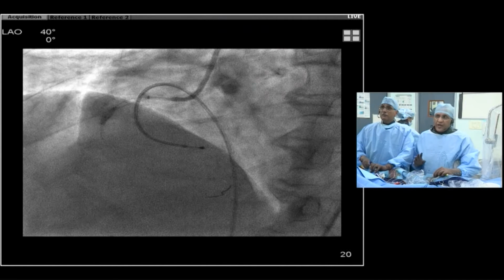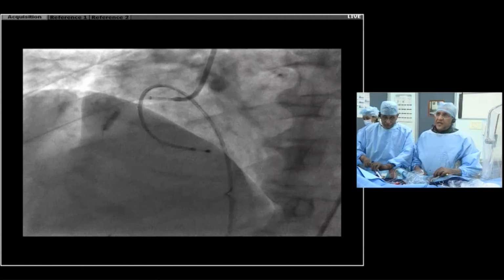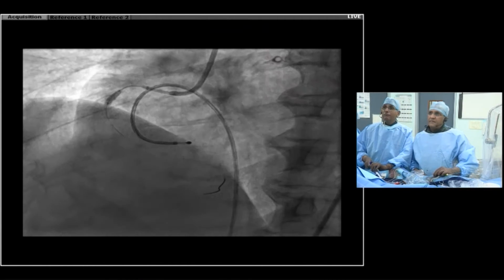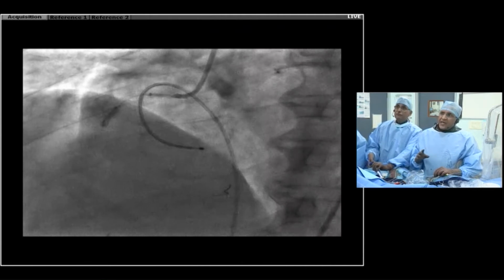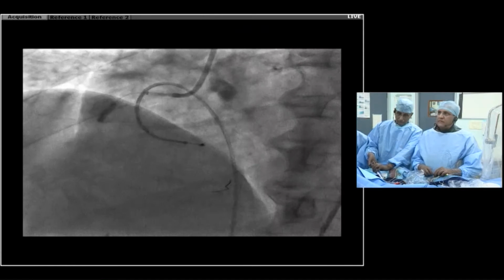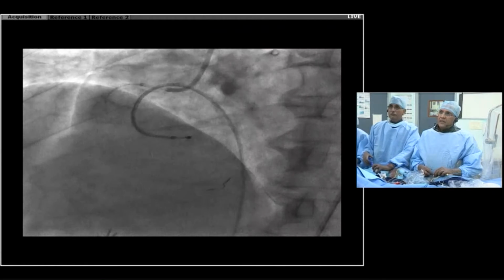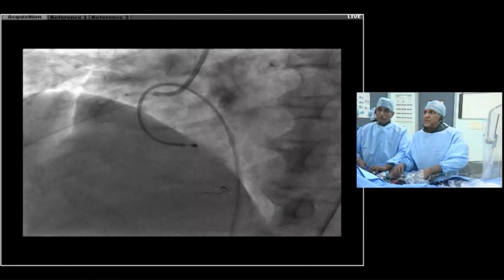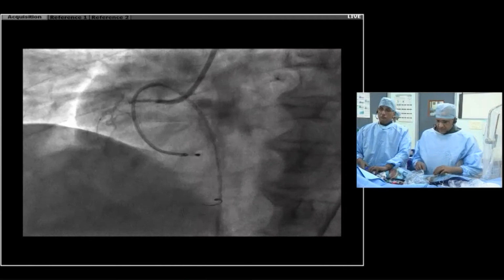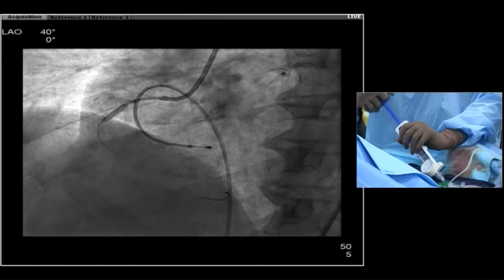I took it off the shelf for native coronary arteries. You can see it is at 6 atmospheres and it's completely expanded. That's fine. So you can be quite sure that a lot of the circumferential calcium can break after rotablation with just an NC at a low pressure. I think an important point is also to try to choose a stent with very good radial force, just in case you need some more aggressive postdilatation. The balloon is opening perfectly.